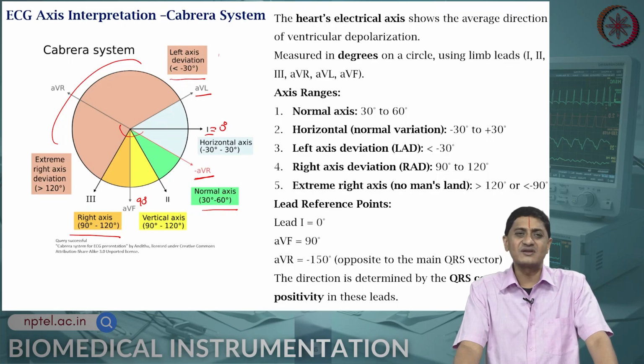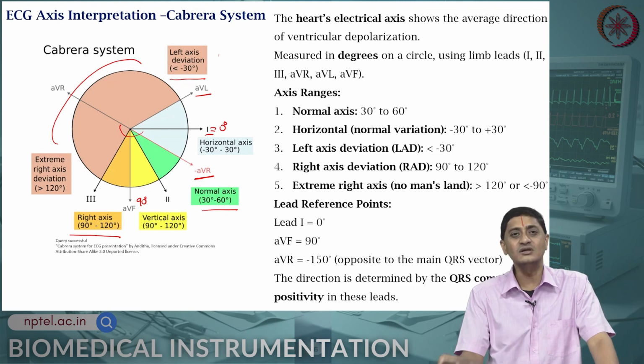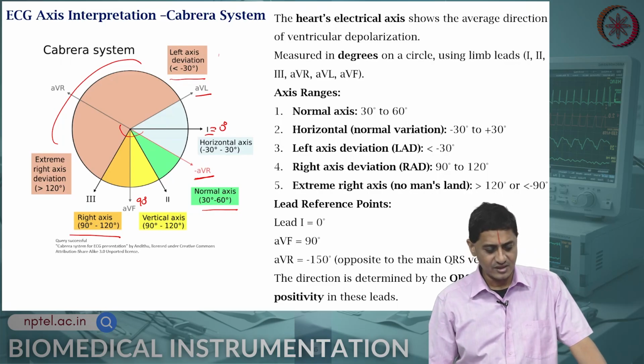This is approximately what is happening with the multiple leads. Each lead can be compared to one of the security cameras. Alone they may not provide the full information, but they do contribute something to the total information. This is a reasonable comparison for our better understanding.